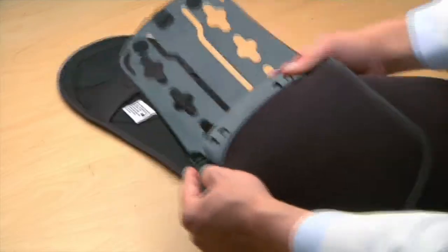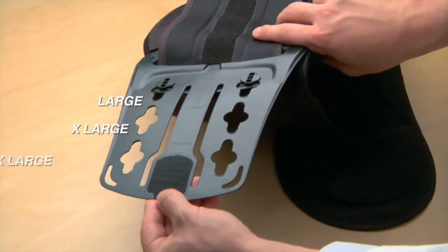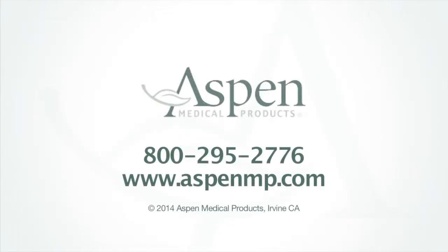Note that smaller sizes connect to the inner side of the sure slot panel, while larger sizes connect to the outer side. For questions or further information about the Summit line, please call Aspen Medical Products at 800-295-2776 or visit us online at www.aspenmp.com.